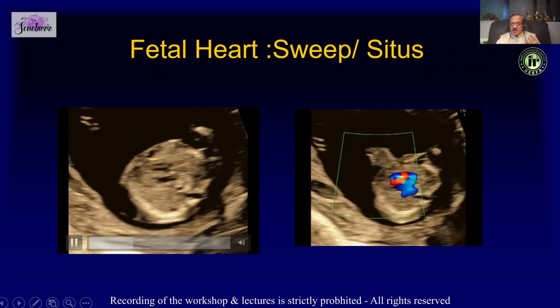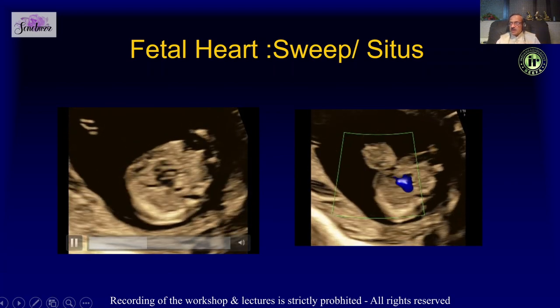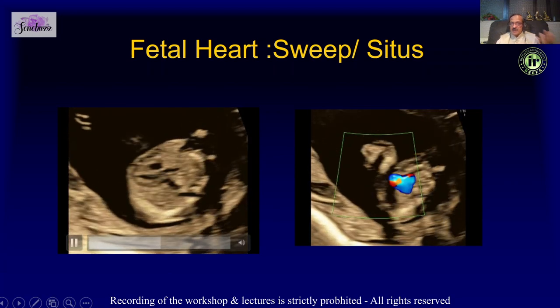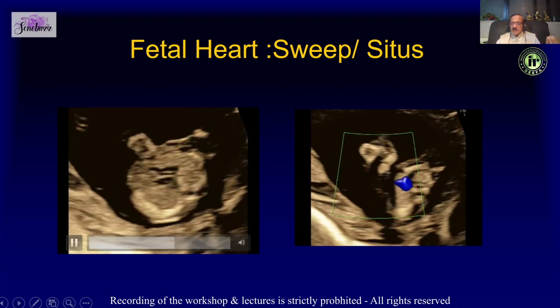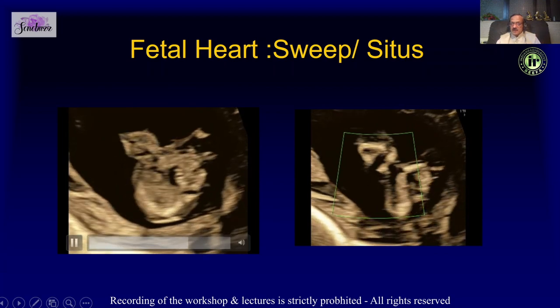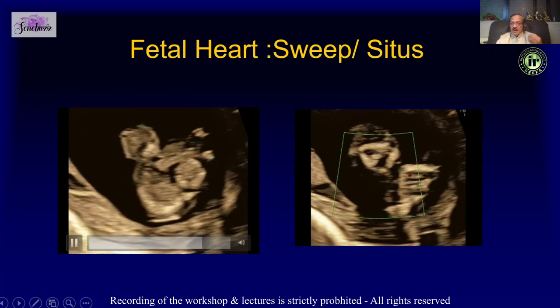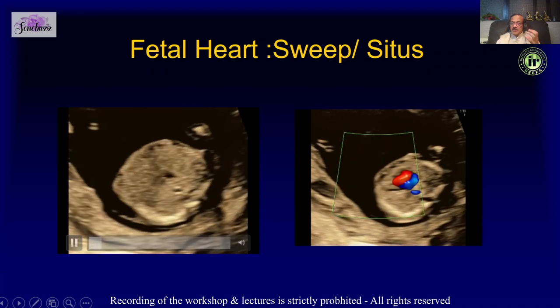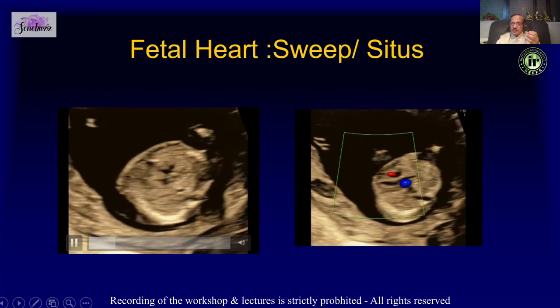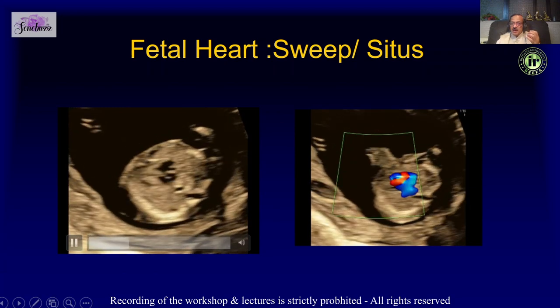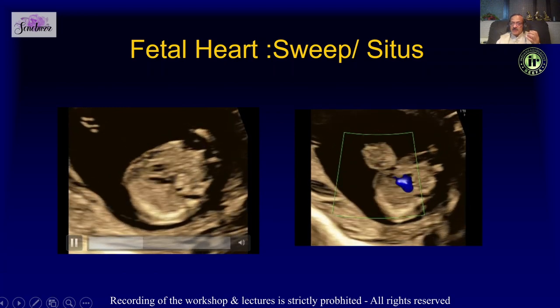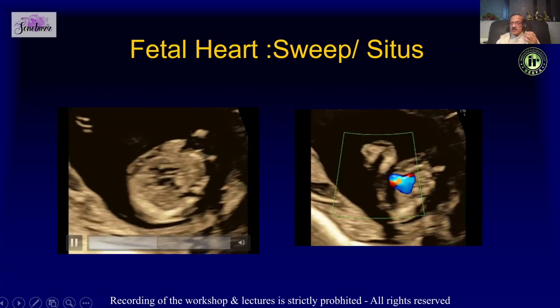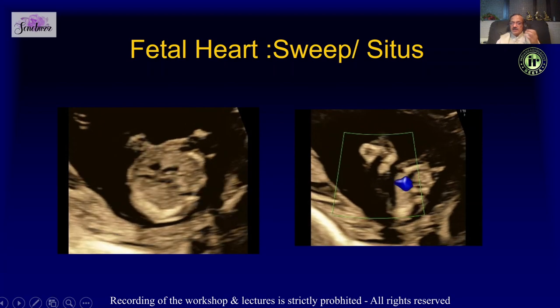If the axis of the heart is on the left side and the heart grossly has a good size, then you have done a good job. Confirm that the stomach and heart are on the same side, the aorta is on the correct side, and that the situs of the fetus is normal.